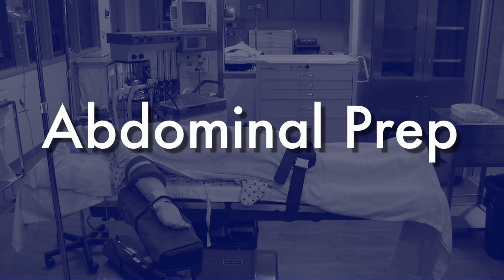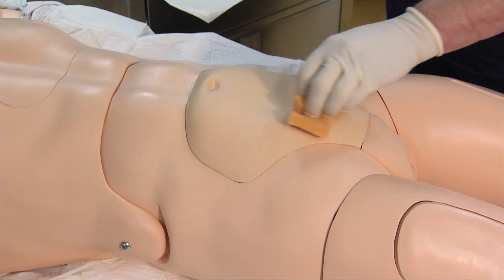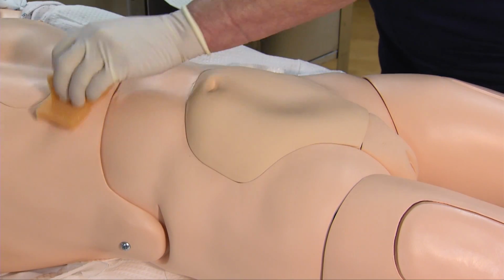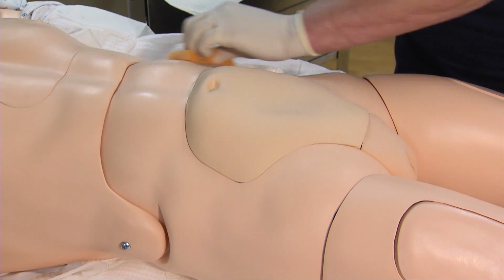Abdominal Prep. Please note that for demonstration purposes, the iodine solution will not be applied to the surgical mannequin. The surgical prep involves application of an antiseptic solution to the patient's skin for the purpose of reducing the microbial count on the patient's skin to an irreducible minimum because the skin cannot be sterilized.